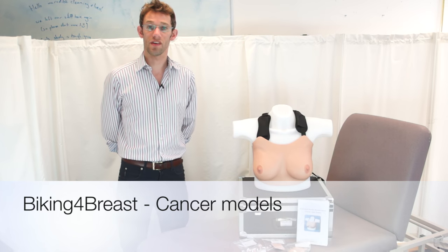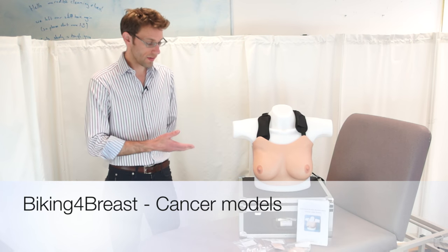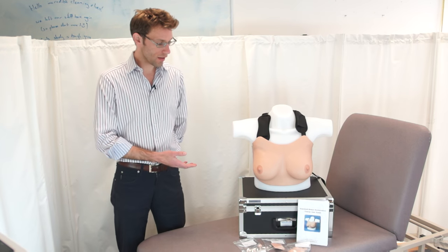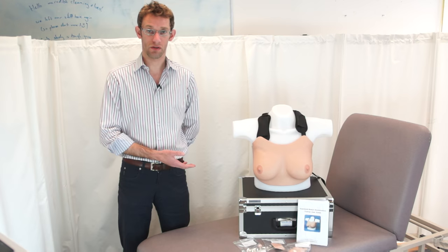Hello, my name is James Gill and today we're going to have a quick look over the latest breast cancer training models that we have from Adam Rooley here at the Medical School.